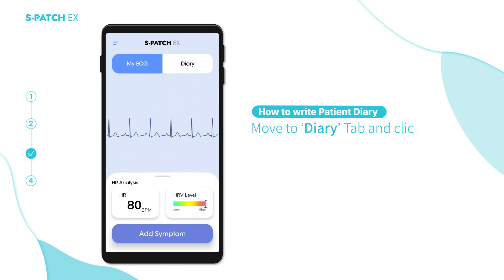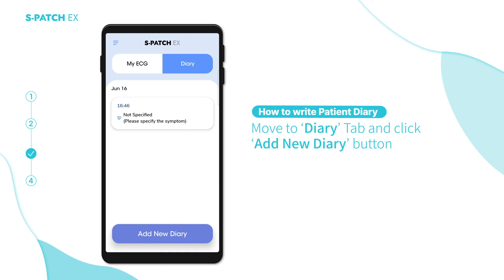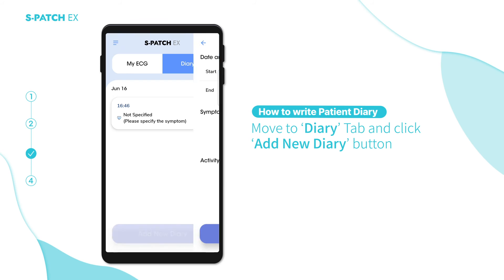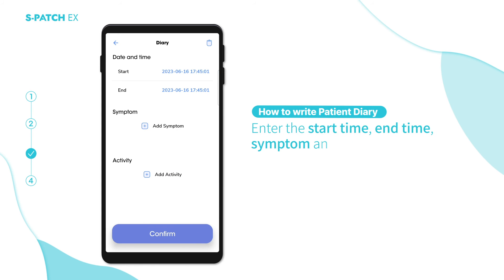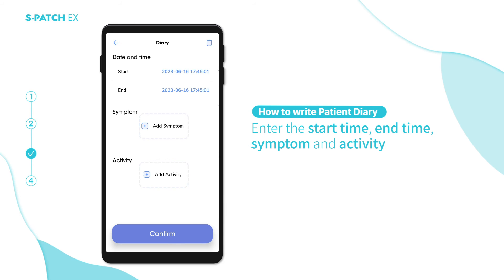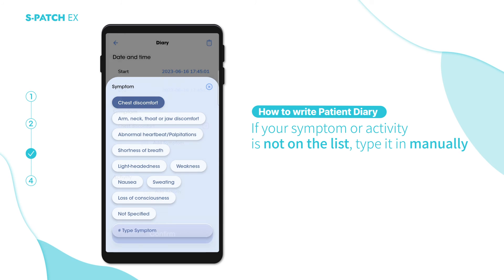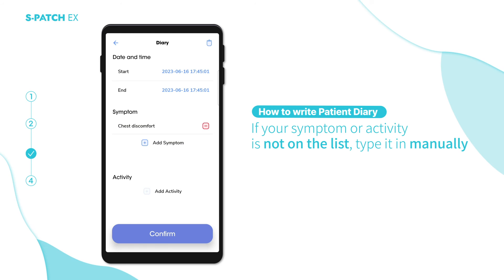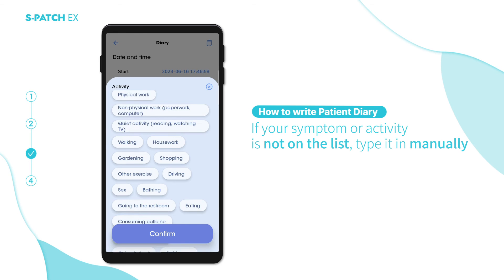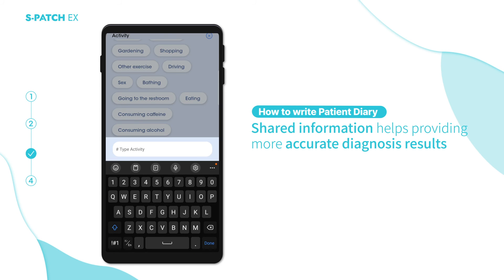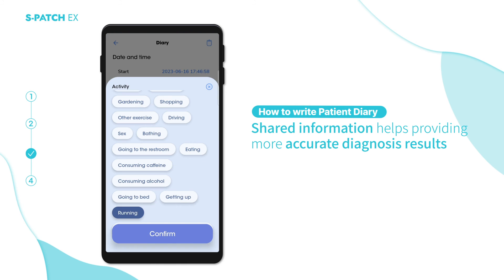To write a patient diary, move to the Diary tab and click the Add New Diary button. Enter the start time, end time, symptom, and activity. If your symptom or activity is not on the list, type it in manually. The shared information helps provide more accurate diagnosis results.